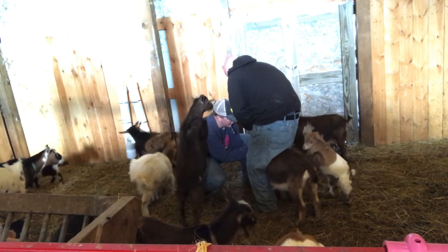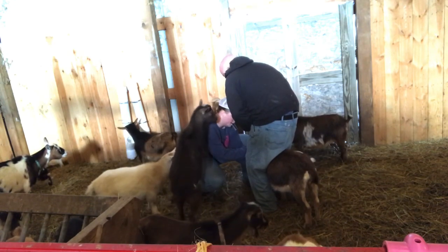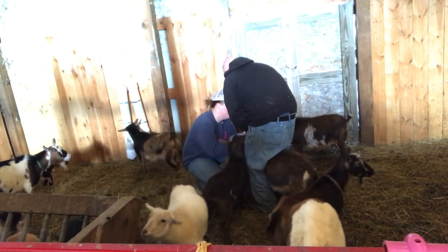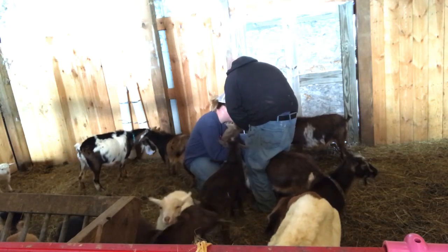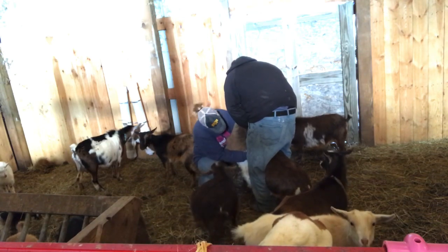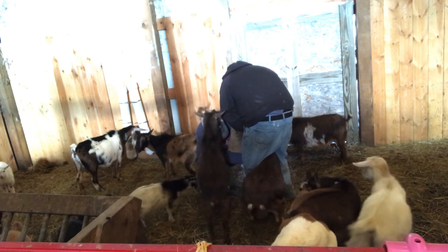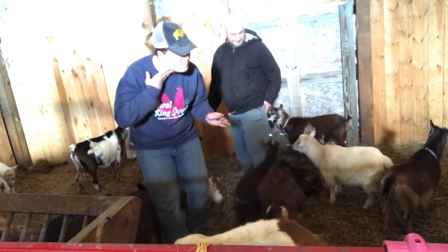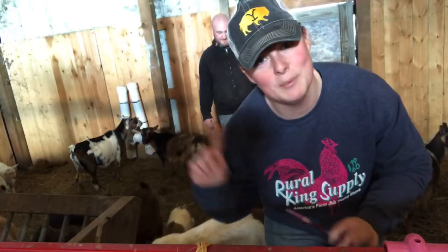It might be a good idea to do this away from your other goats, as you can see — Tiger Lily's chewing on my hat, Apollo comes around and gets up between my arms, reaches up, and soon you're going to see that he ends up biting me in the neck while Tiger Lily is in the way. And there he goes — he's biting. So a good practice may be to move the other goats out of the way while you're doing this. I got bit, he got his drawstring eaten — it might be good to put the rest of them away.